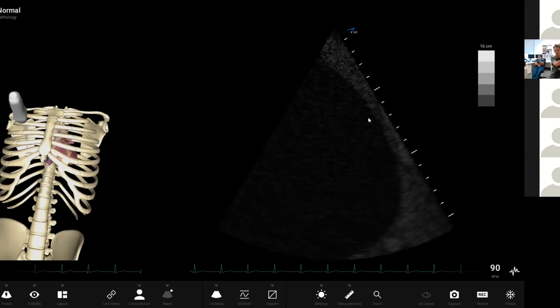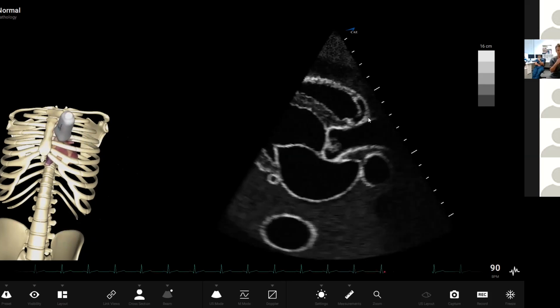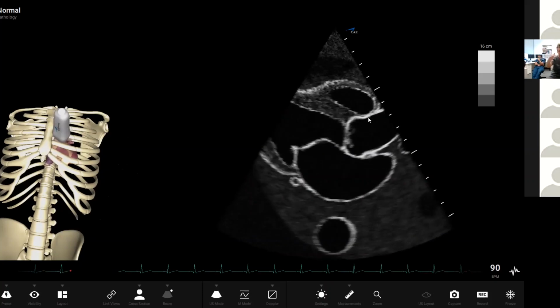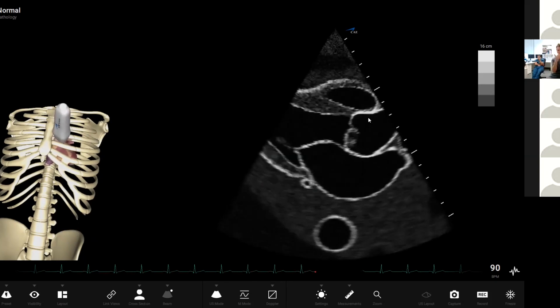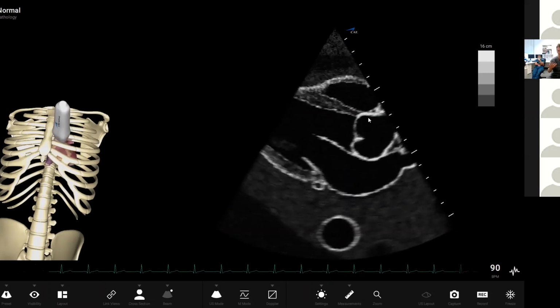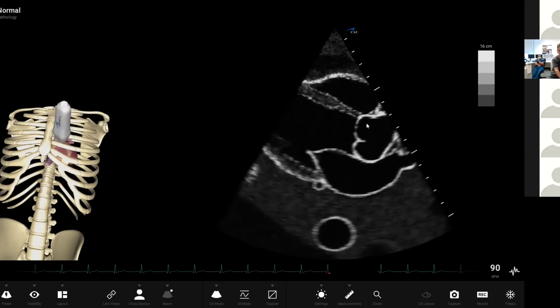Get yourself in a nice position with your arm level so you don't get shoulder injuries. Give yourself the best possible opportunity and have your echo machine at eye level, with the machine and buttons easily available, because your right hand for optimization is going to be doing more than your left hand. Okay, so that's the basic stuff, getting the room lighting right and all of that. In an exam question, obviously you start off with that stuff. But let's get into the nitty gritty of the tips and tricks.